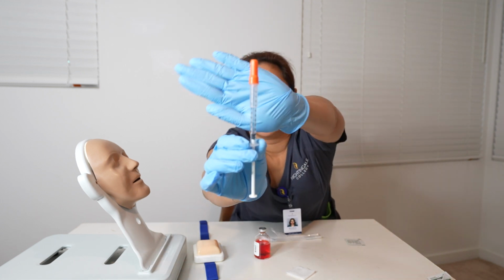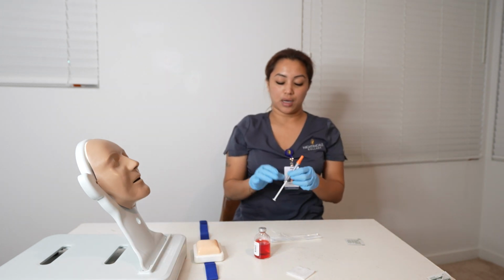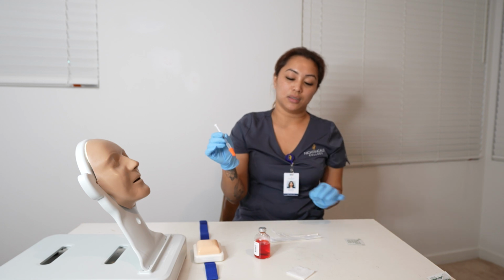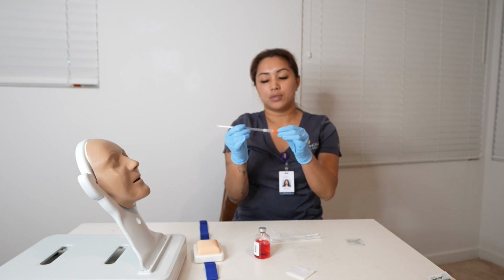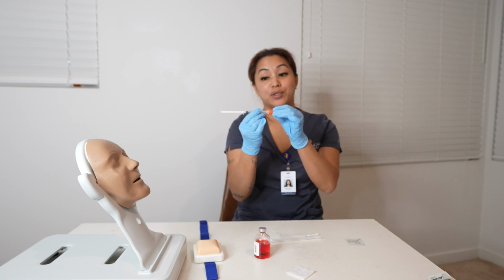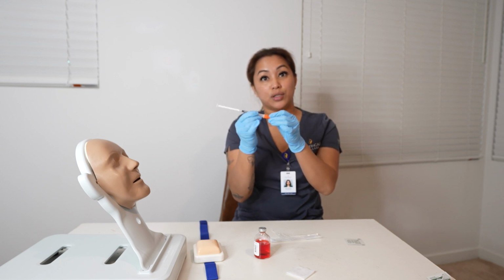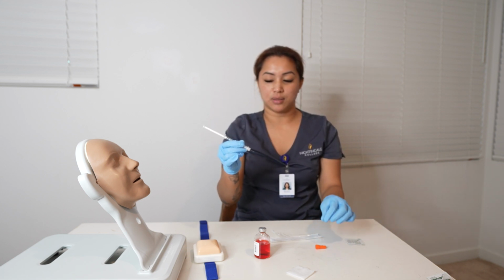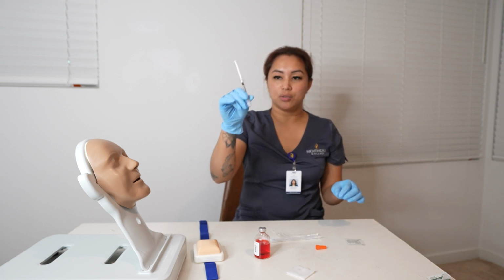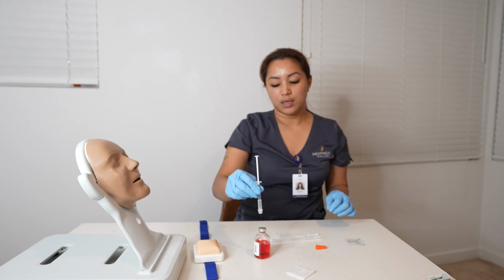Now we are going to draw 1 ml of air while the cap is still on. Alrighty. 1 ml. Perfect. Now that the medication vial is dry, we are going to uncap the syringe. I did not hold the plunger, and it is still at 1 ml. Uncap the syringe, place this cap onto there. So now we are going to hold it like a dart straight down into the medication vial.